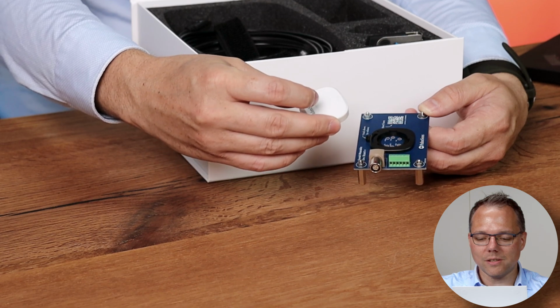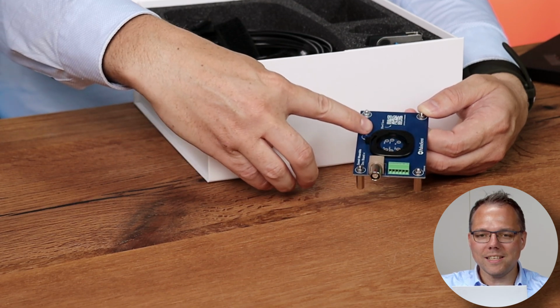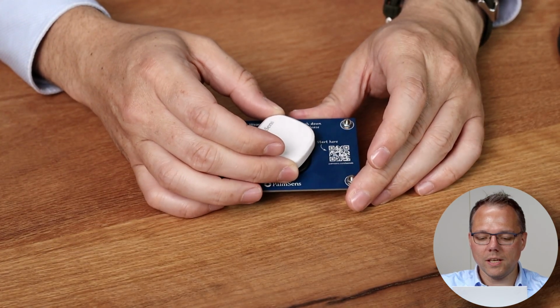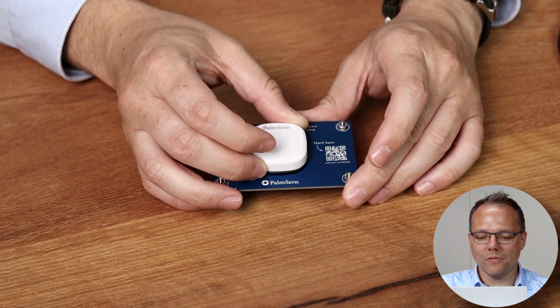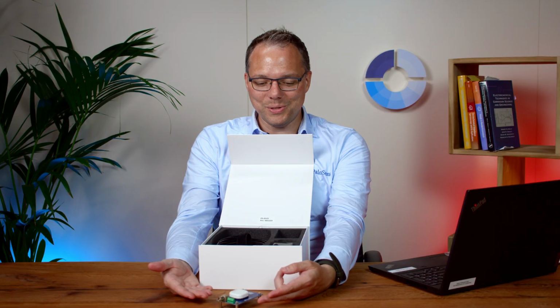If you want to mount your Sensit Wearable on the breakout board, just look for the little dot that's on it. It's, by the way, at the same point where the USB-C port is. And you have here on the mounting bracket a small dot. You just put them on top of each other. You turn clockwise 45 degrees. You hear it click. And now your Sensit Wearable is on the breakout board.